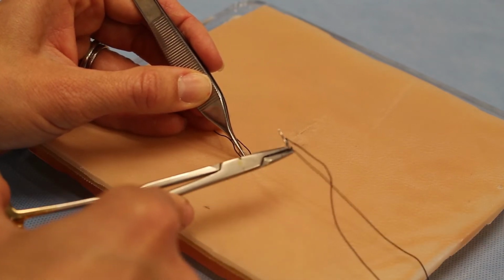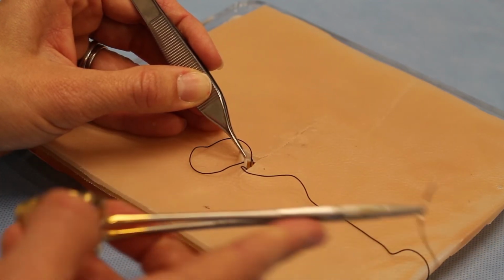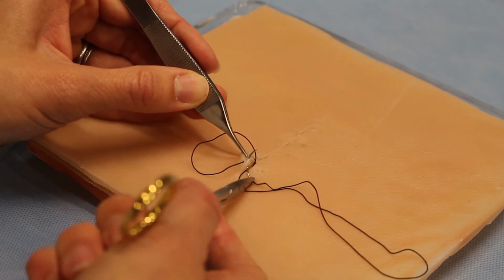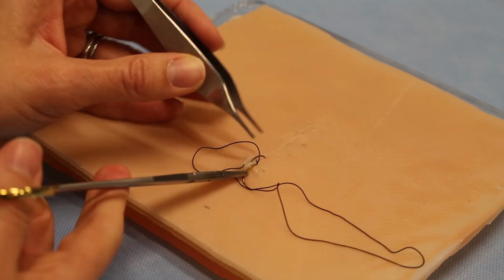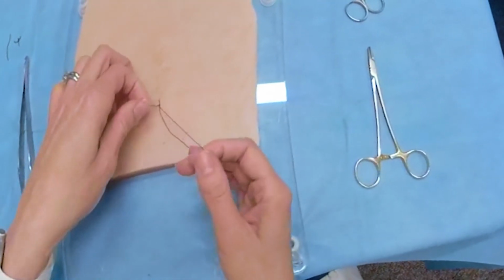This stitch is coming from deep. These two are coming from superficial. So if I tied this together right now, which I could, and a lot of people do, but my knot would have two anchors in superficial and one in deep. So what I like to do is grab a whole bite that's just deep. You see that's all deep. It's all in the dermis. Nothing's right up at the skin edge. And I pull that through. Now all three of my sutures are coming from deep.